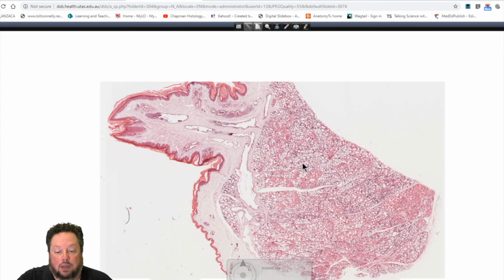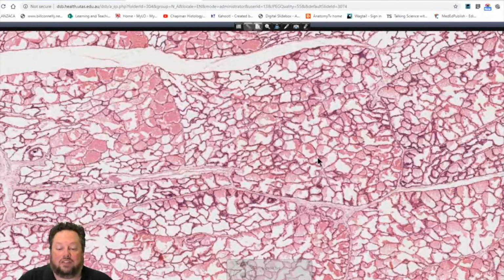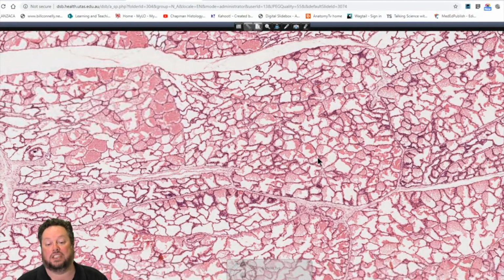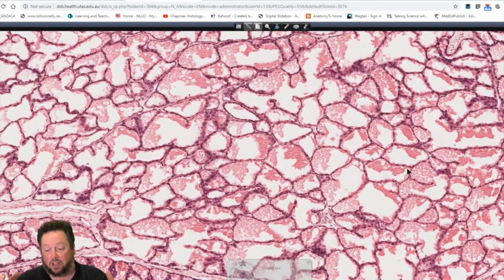And then when they're actively lactating, it has an extraordinarily different appearance once again. Most of that connective tissue disappears and it just becomes these large secretory components. And you can see from this section why it's considered an alveolar type of gland, because it looks like lung. It looks like the alveoli of lung, with the difference being that there's actually milk inside the alveoli. So unless you're inhaling milk, your lung shouldn't look like this.